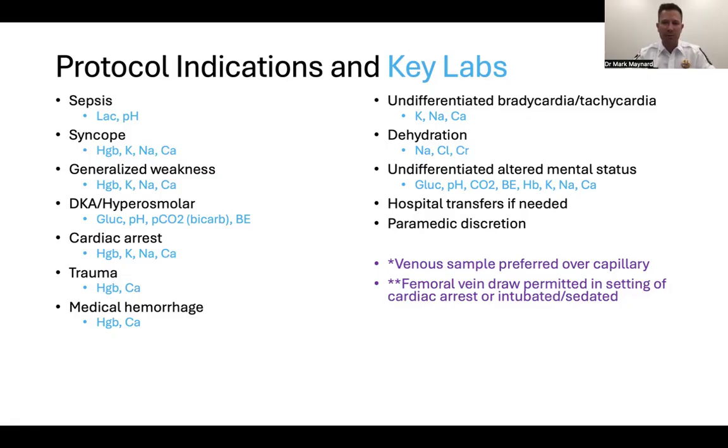During a cardiac arrest or if a patient is intubated and sedated, we can do a femoral vein draw where we would stick a needle into the femoral vein and draw out blood if we were having trouble getting the blood sample. By the way, we can only take whole blood samples. We cannot take IO aspirate because it will not work in the EPOC system. All right, remember that the samples need to be run within 1 minute. Actually, I think technically for the EPOC, it's 30 seconds. And so you want to have your sample ready by the time it is ready to accept it.